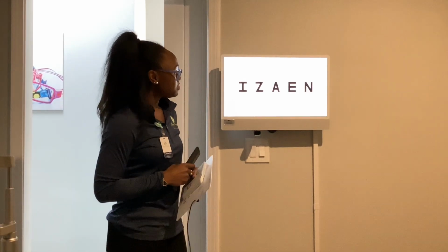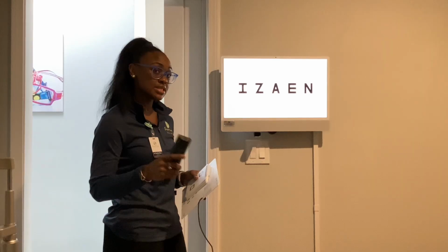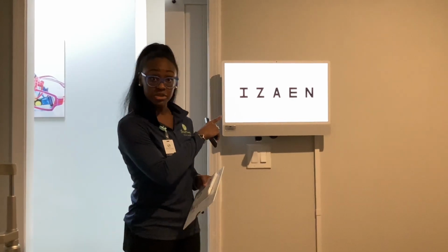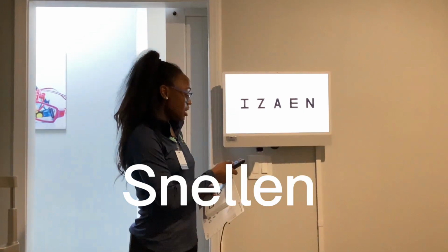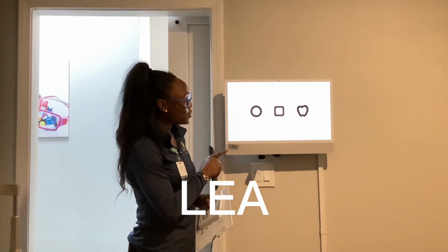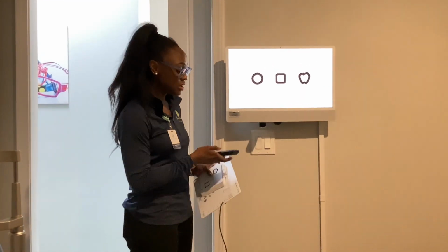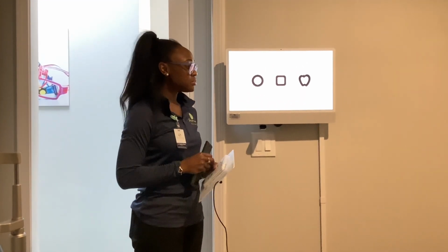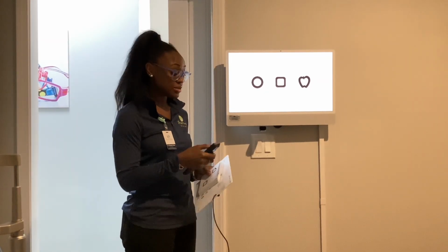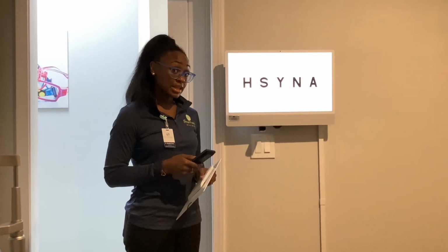So this first video will be about visual acuity, which is the basics of pre-testing. When a patient comes in and sits down, depending on the age demographic, we will do Snellen acuity, which is with the letters right here, or we'll do Leah symbols, which you'll see a circle, a square, an apple, and a house, depending on which room you're in, okay? So general rule would be if they're 5 and over, assume that they are pretty comfortable with doing letters, which is the Snellen acuity. What I like to do is isolate letters, okay?